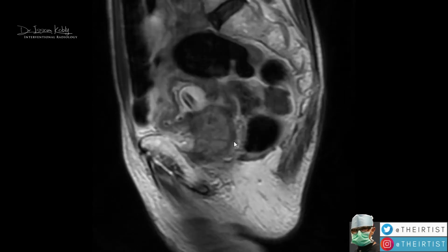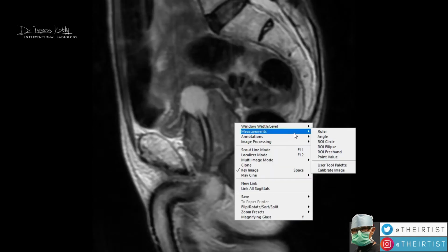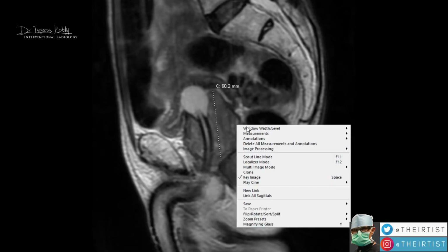It is an enlarged prostate gland, and we're going to measure it a little bit and see how much it has a little component of intravesical protrusion of the prostate, of the median lobe. So this is what we're going to target on the PAE. This is our target, this median lobe, the protrusion of the prostate.